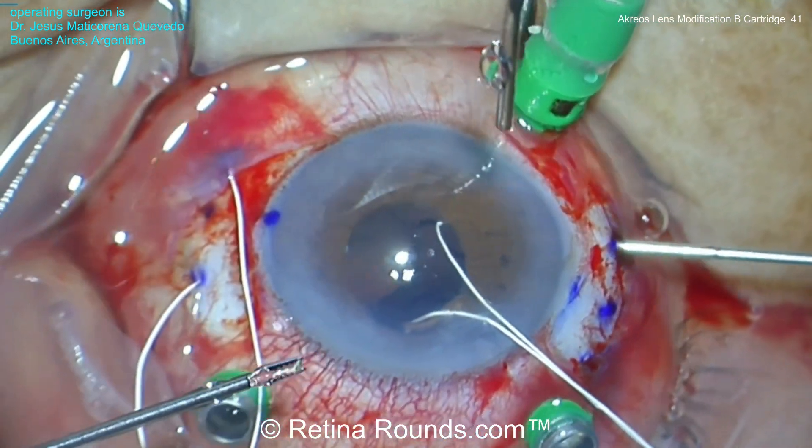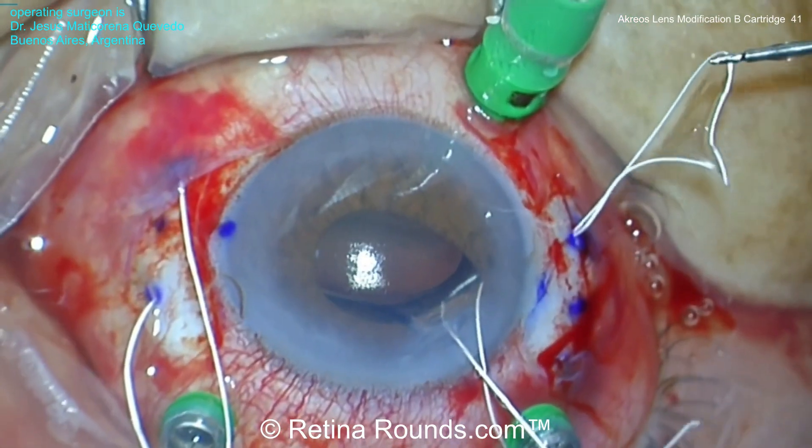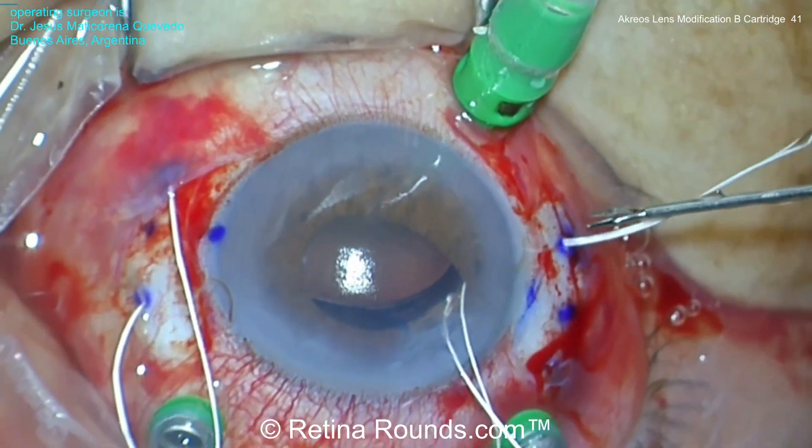Again using a handshake maneuver, the Gore-Tex suture from the other side of the IOL is externalized through their corresponding sclerotomy sites.